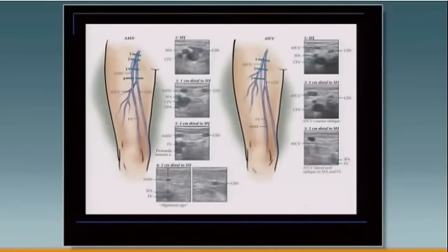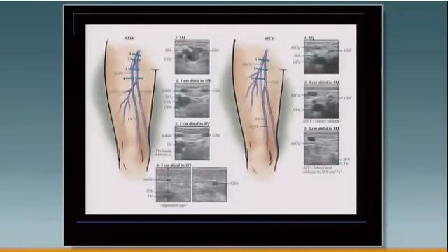Something that one can do with mapping is illustrated here to demonstrate the difference between an anterior accessory saphenous and an anterior thigh circumflex. As we follow down the thigh, you'll notice that the accessory saphenous vein is always aligned with the deep vessels as one scans down. The great saphenous vein is medial; the accessory is aligned with the femoral vessels — we call it the alignment sign.